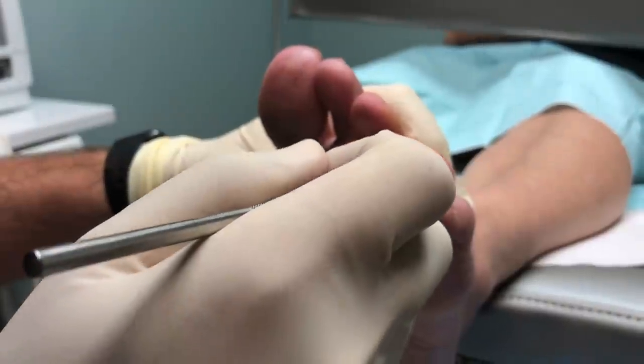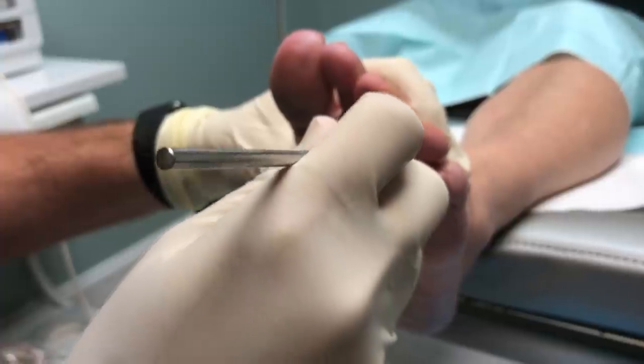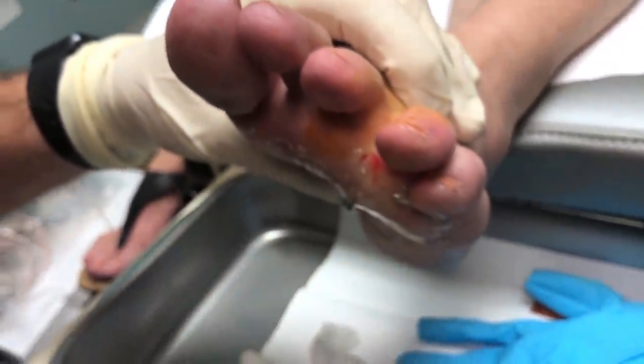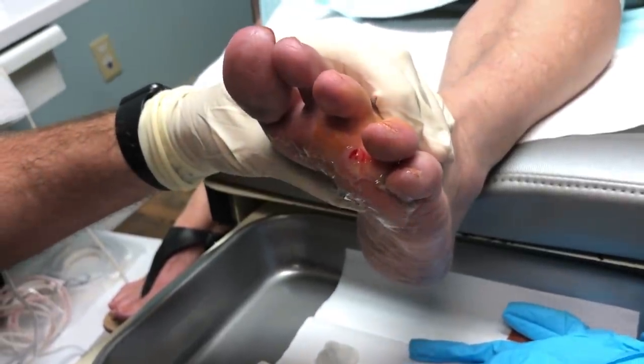Do you feel anything at all? I can feel you pushing on me. Any pain? No. We just go with a little stab incision here — right through. That's the only incision that we need. Tim, can you grab me that probe, please?